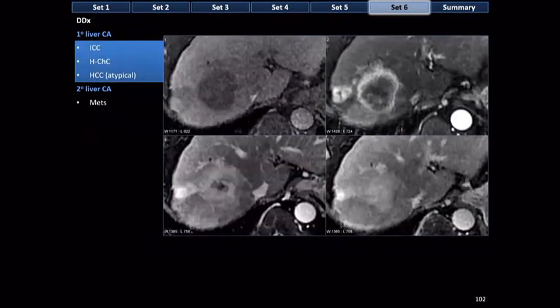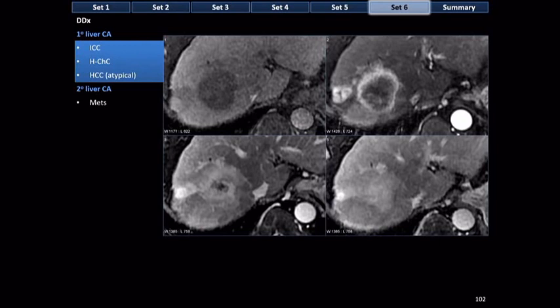Finally, a cirrhotic patient: ring enhancement in the arterial phase with no washout — but the outer rim has faded. The lesion holds onto contrast centrally, while the outer rim washes out — peripheral enhancement with peripheral fade or washout. This is a malignancy. In the setting of cirrhosis, the differential is cholangiocarcinoma, hepatocholangiocarcinoma, or an atypical HCC.